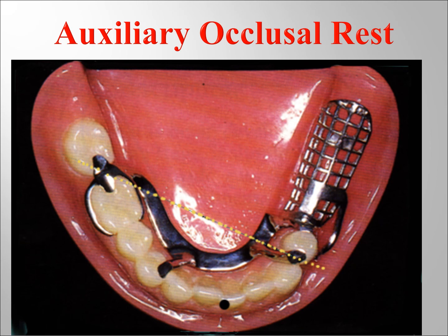Of course, the best thing to have, now, this is a class 2 prosthesis where it has a distal extension. If you imagine the movement of the distal extension away from the tissues, there will be rotation around the fulcrum line on the retentive tips of the most distal abutments: the premolar on the distal extension side and the molar on the other side. Now a rest was extended on the premolar mesio-occlusally to provide indirect retention.